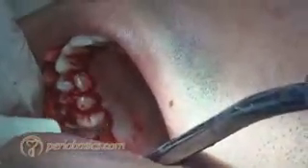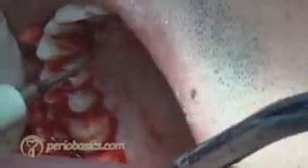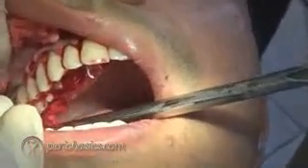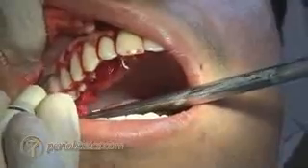Then we start with the scaling of the root surfaces. As you can see, all the root surfaces are visible clearly now. So we do the scaling both on the palatal and on the buccal aspect to remove all the deposits on the root surface, including the calculus, and you can see that scaling has been done.